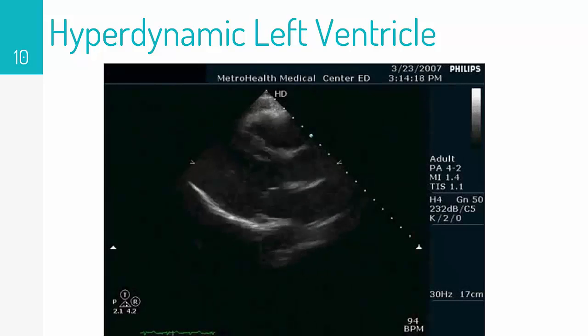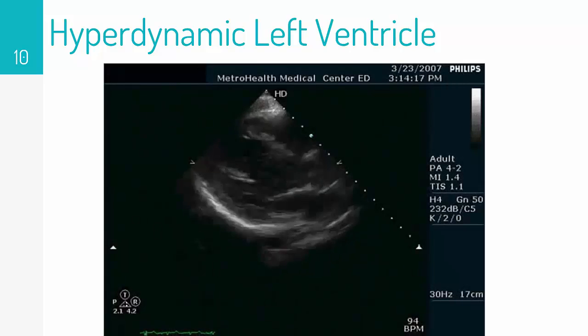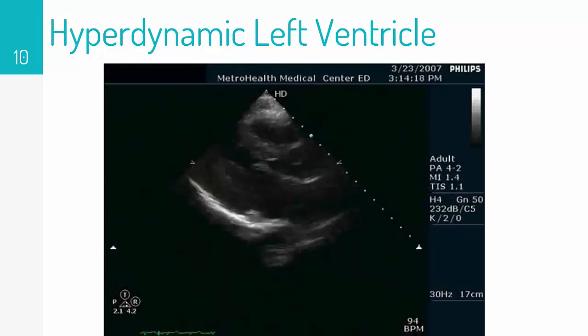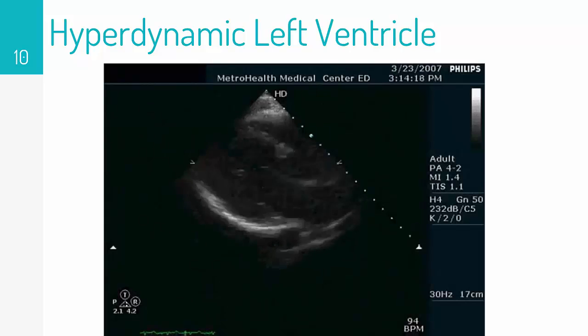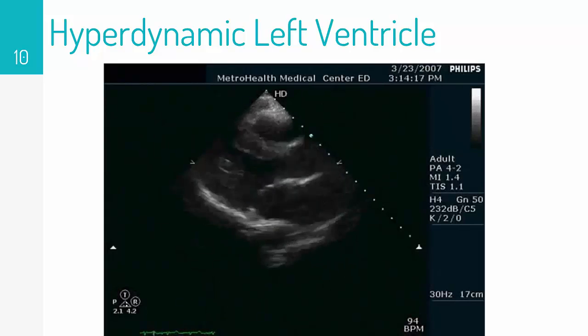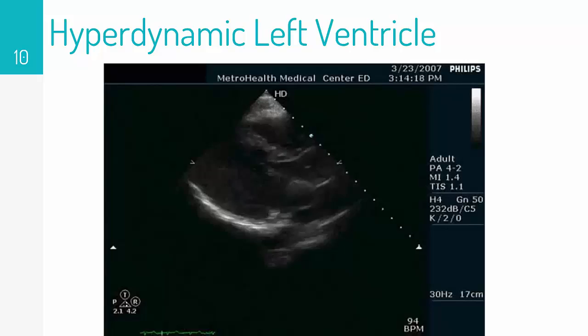So here, this is an example of a hyperdynamic left ventricle. In contrast to the last clip, this video demonstrates a hyperdynamic heart evidenced by almost complete collapse of the left ventricle between systole and diastole.